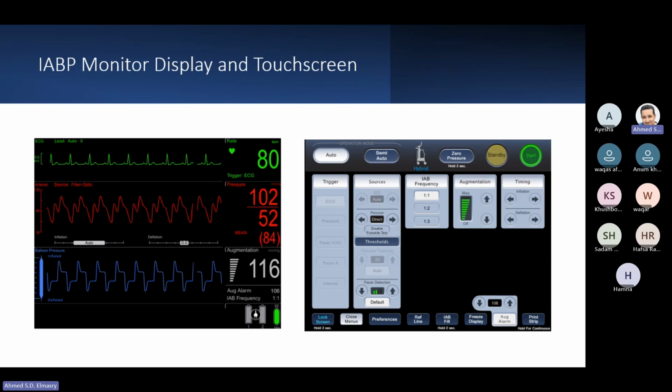So sepsis and increased dilatation will lead to this condition, which is vasoplegia. Vasoplegia makes the balloon occlusivity suboptimal, and also the inflation point of the intra-aortic balloon will be low because the aortic notch will be lower than normal.